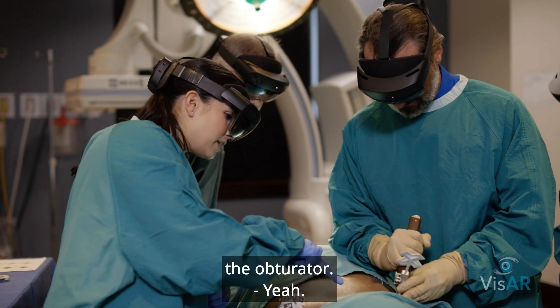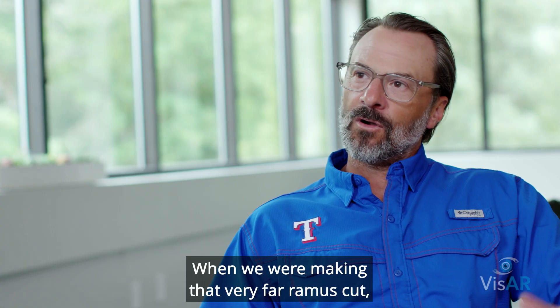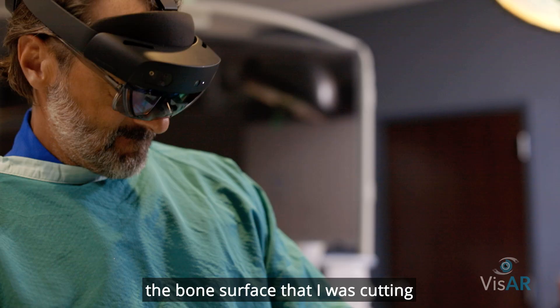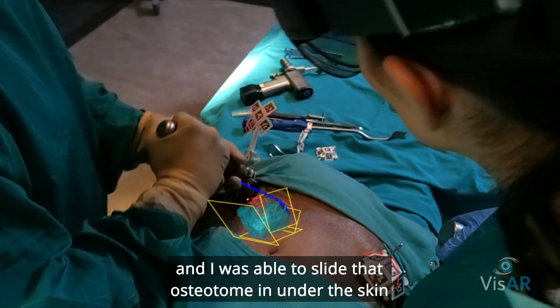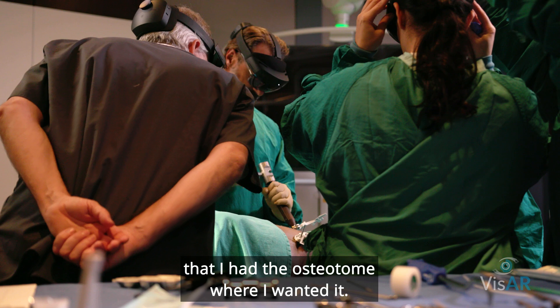It's cool because I can see through the obturator. When we were making that very far ramus cut, I tried to do it without visualizing the bone surface that I was cutting. I was able to slide that osteotome in under the skin and then see through the headset that I had the osteotome exactly where I wanted it.